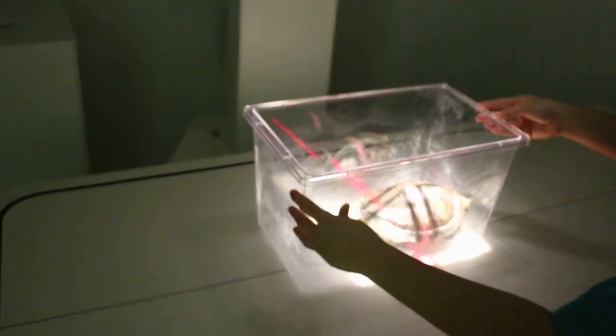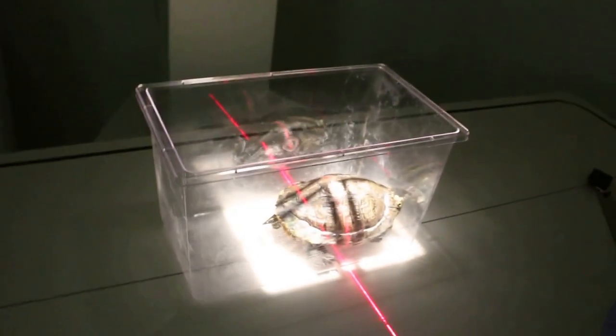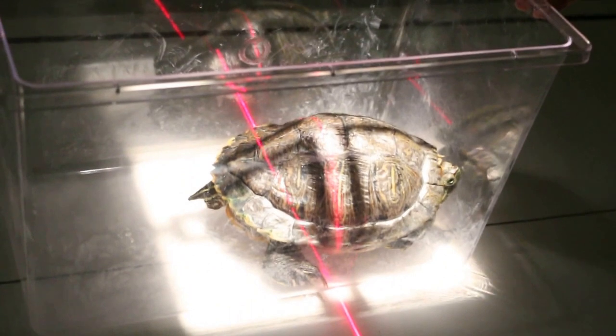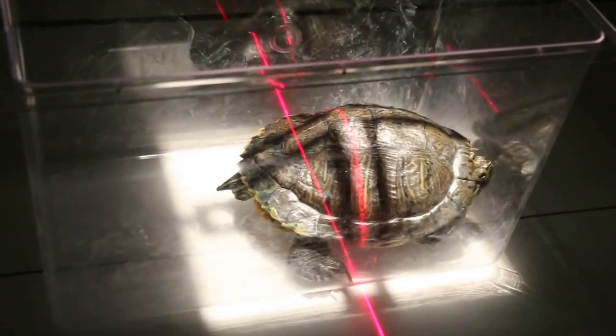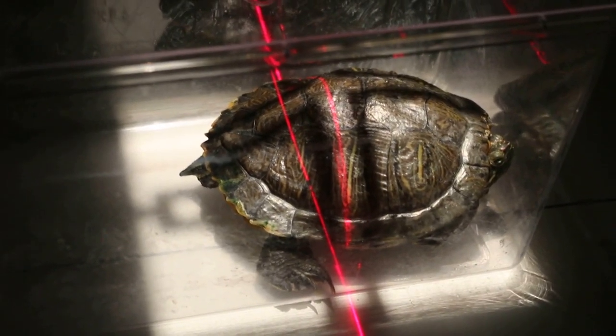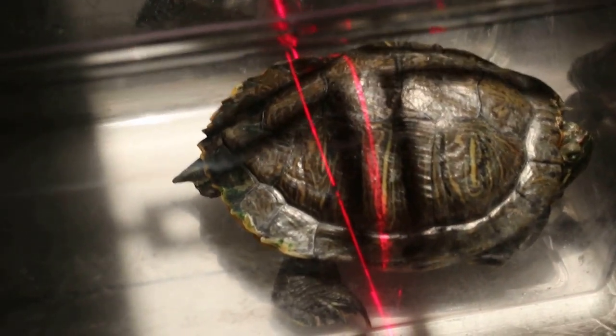We want the oviduct here, more to the lower part. The container should be transparent — okay, it's not moving. We want to see the eggs inside.